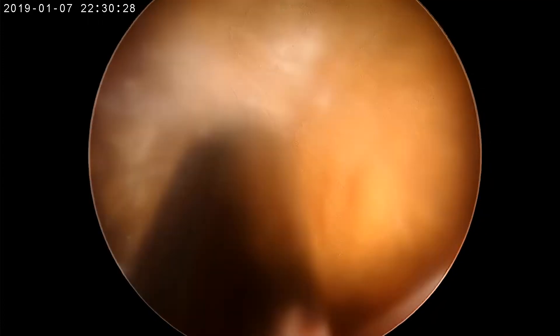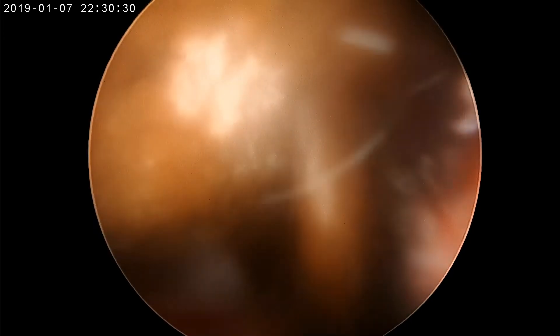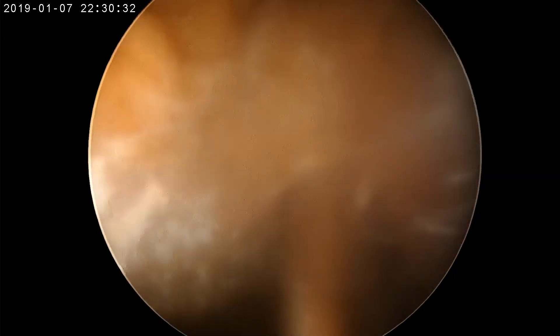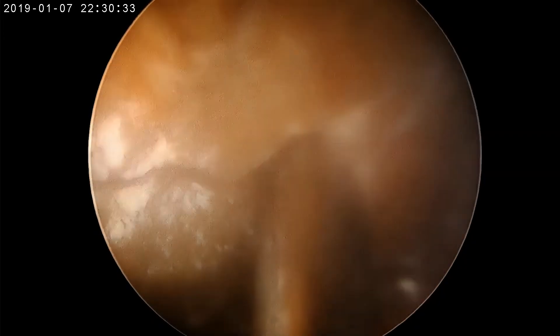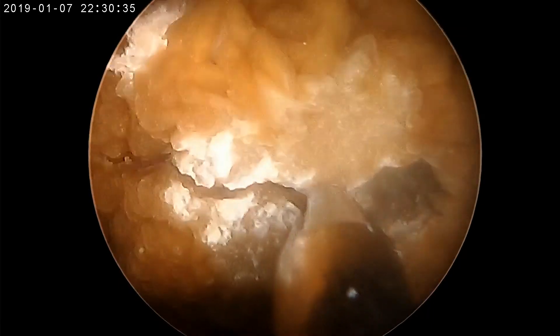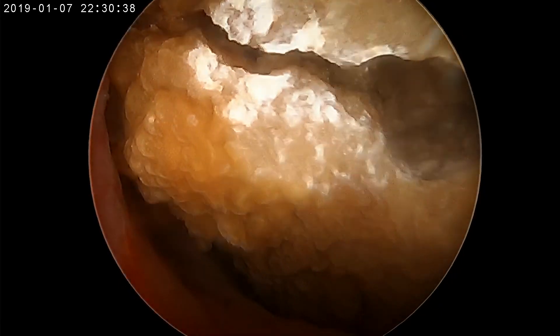The pelvic stone is now visualized. After performing pneumatic lithotripsy, the stone was completely cleared in 30 minutes.